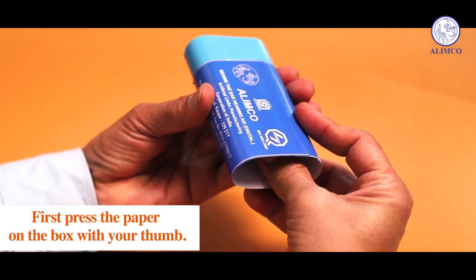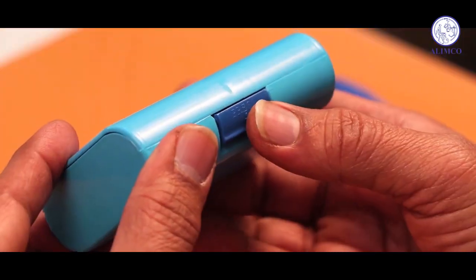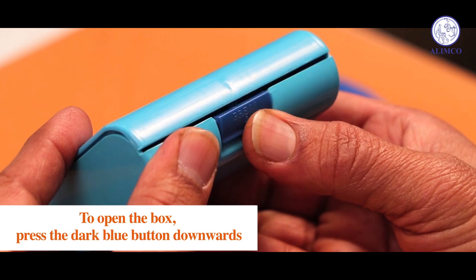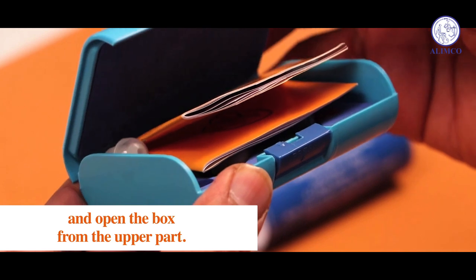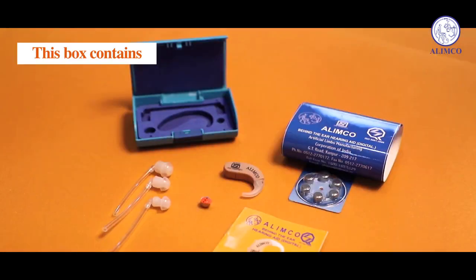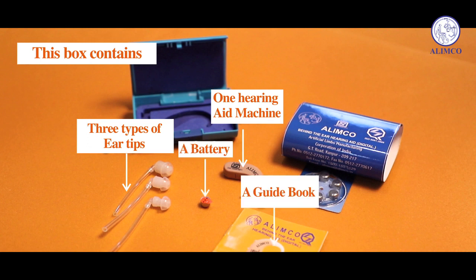First, press the paper on the box with your thumb. To open the box, press the dark blue button downwards and open the box from the upper part. This box contains one hearing aid machine, three types of ear tips, a battery, and also a guidebook.